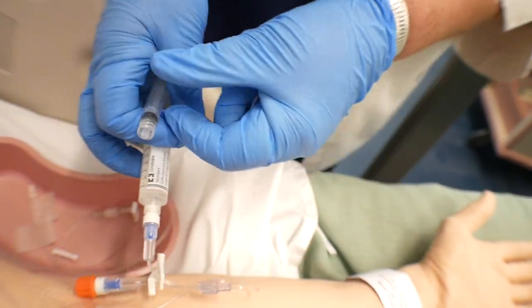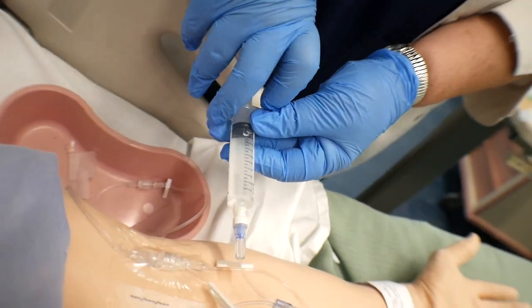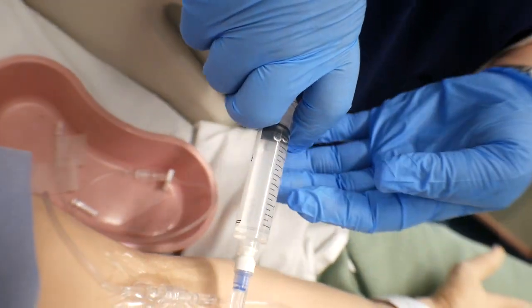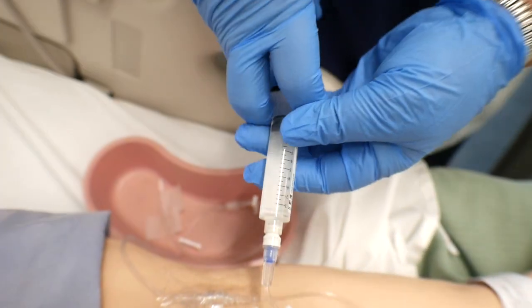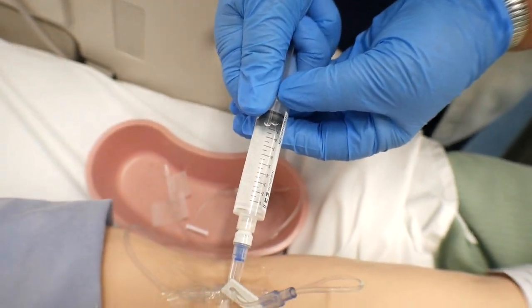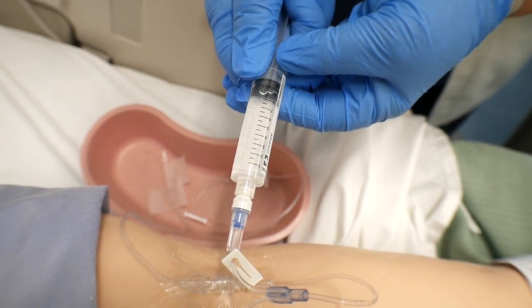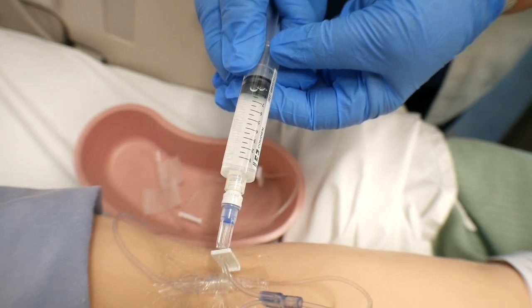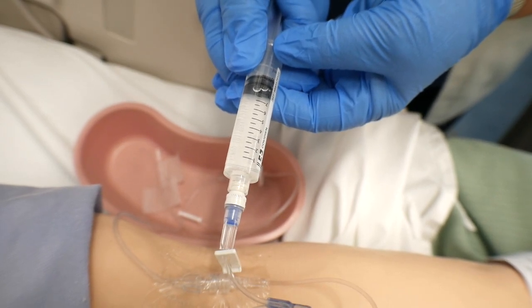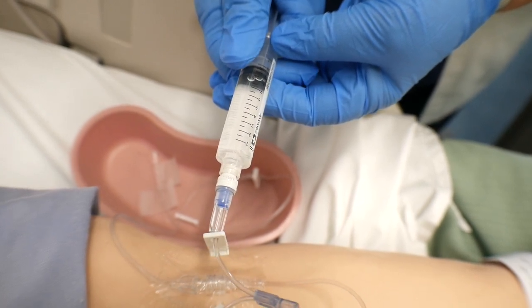And this will be saline to flush it. So the first milliliter, I'm going to do it slow again, just to make sure. So that was about 1 milliliter over that time.